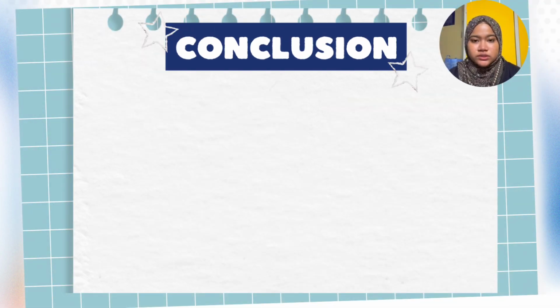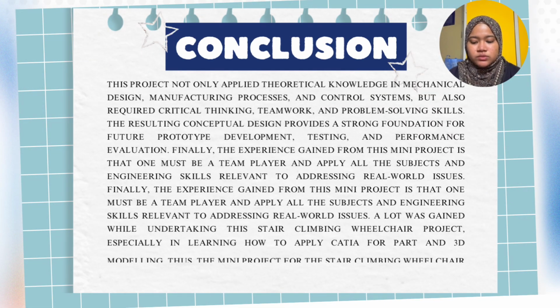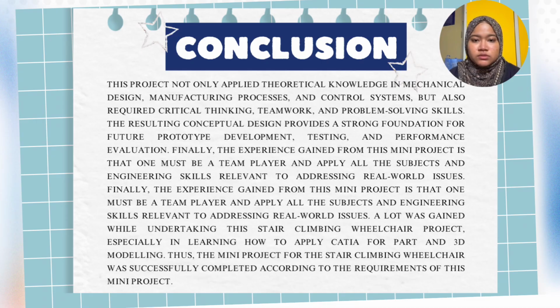So in conclusion, this mini project successfully addressed the limitations of conventional wheelchairs through a systematic and research-based design approach. By focusing on key performance parameters such as stability, safety, maneuverability, and user comfort, a practical and functional stair climbing wheelchair design was developed.